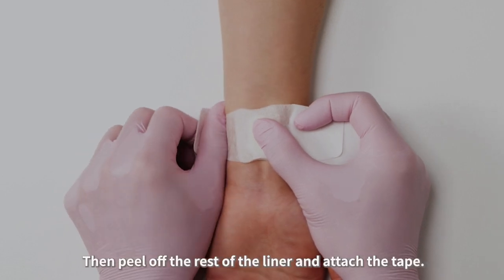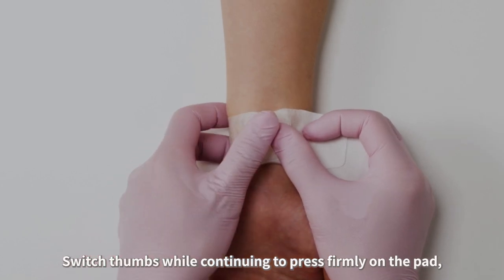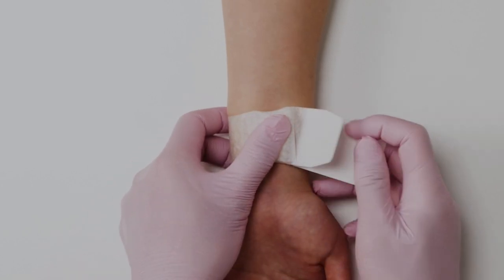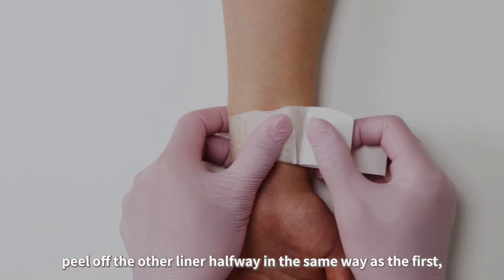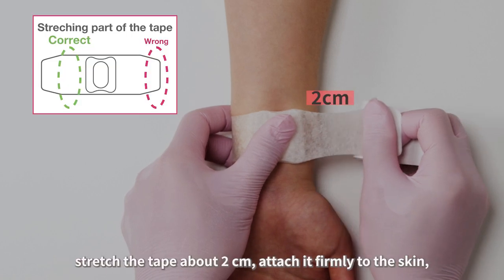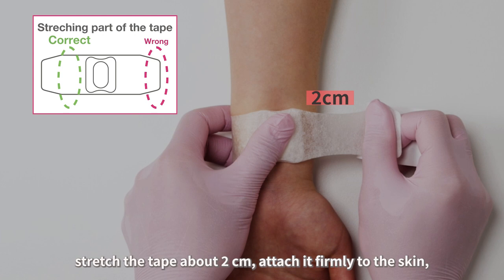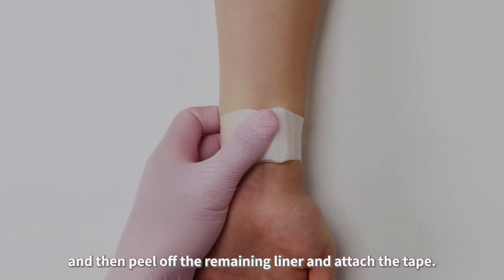Continue to apply firm pressure on the pad as you stick the tape securely onto the skin. Then peel off the rest of the liner and attach the tape. Switch thumbs while continuing to press firmly on the pad, making sure it stays in place. While continuing to apply pressure, peel off the other liner halfway in the same way as the first. Stretch the tape about 2 cm and attach it firmly to the skin. Then peel off the remaining liner and attach the tape.